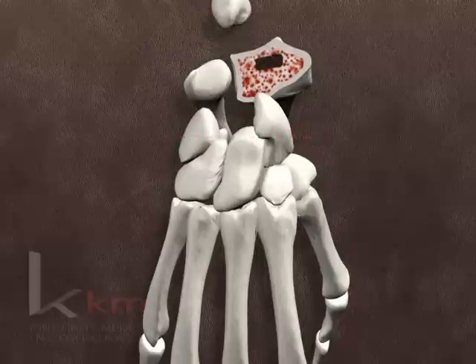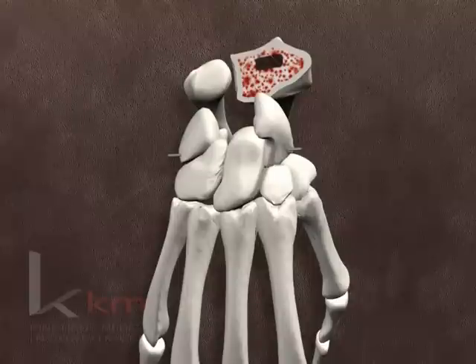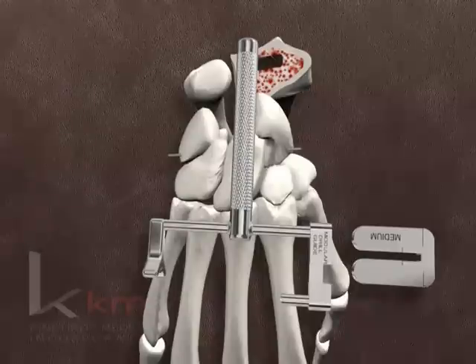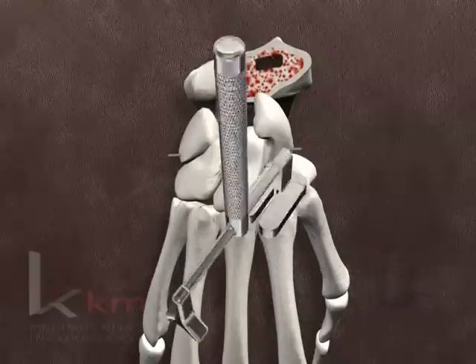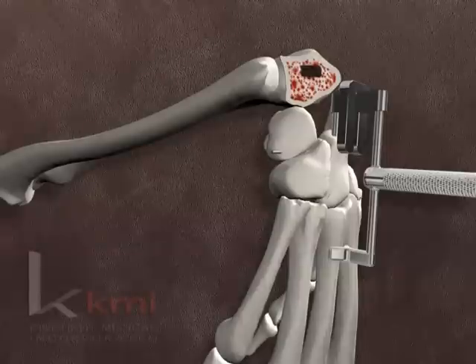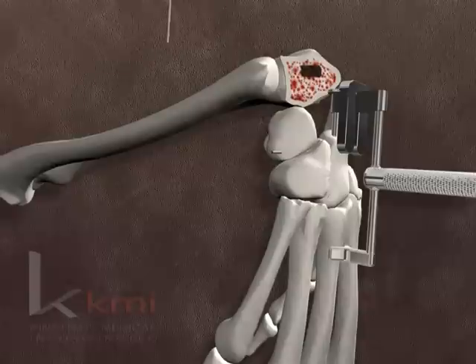The lunate is excised by sharp dissection or rongeur. If the scaphoid and triquetrum are mobile, carpus preparation is facilitated by temporarily pinning these bones to the capitate and hamate. K-wires are inserted through their distal portions just beneath the dorsal cortices to avoid interfering with the osteotomy and insertion of the carpal component. Use of the drill guide plate is optional. When used, the plate corresponding to the selected implant size is inserted into the modular drill guide. The guide plate rests on the dorsum of the capitate, the barrel is pressed against the capitate head, and the saddle is placed onto the third metacarpal shaft over the skin. The sleeve for the guide wire is inserted in the drill guide barrel, and the 1.4 mm guide wire is drilled through the capitate and into the third metacarpal.